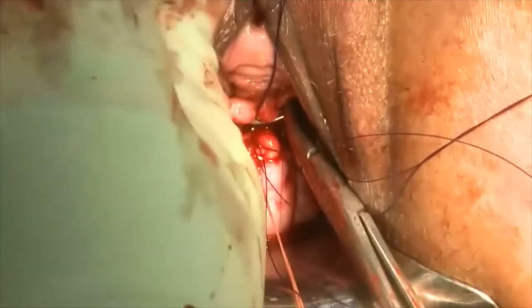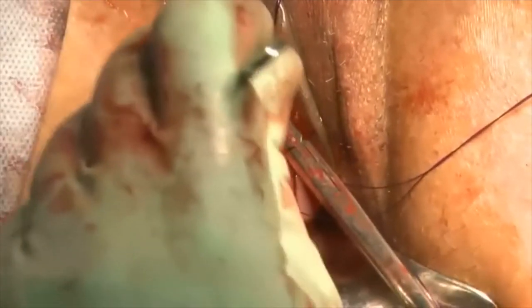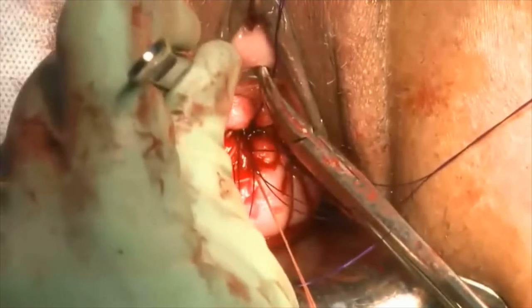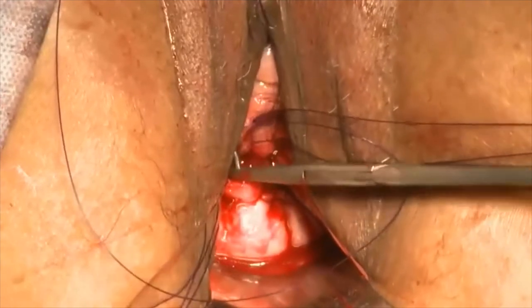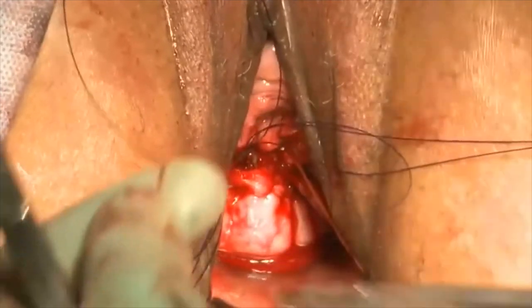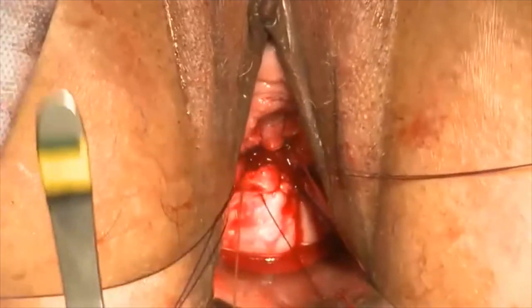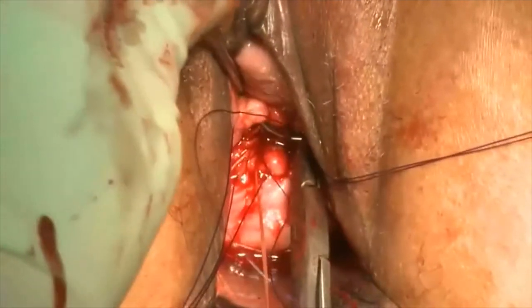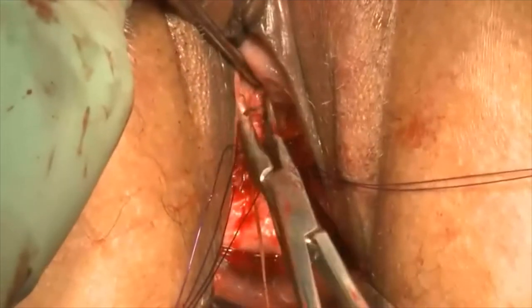This step is then followed by passing the utero-sacral sutures through the vaginal cuff. The most distal suture goes through the corner of the vagina, both anteriorly and posteriorly. The next suture is brought medial to the corner suture, and the most proximal suture, which is the deepest suture, is brought through the middle of the vagina, both anteriorly and posteriorly.